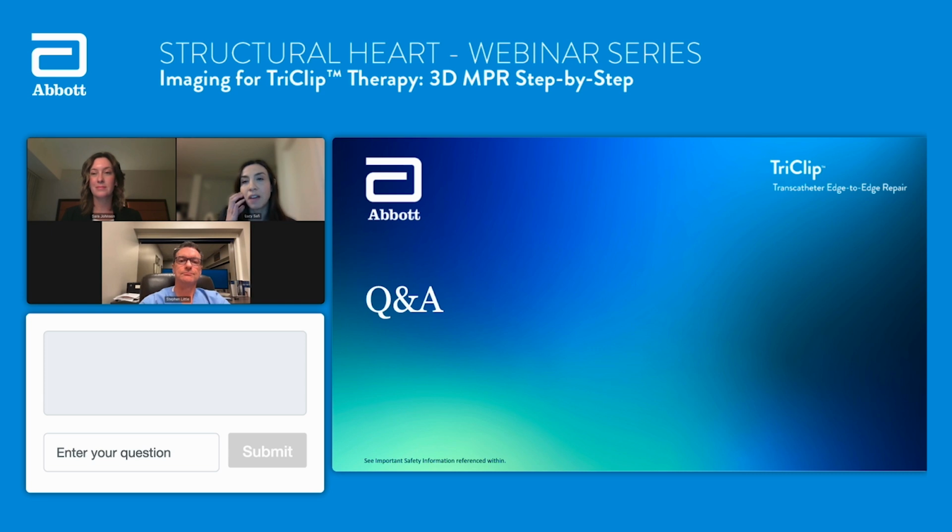I think the fact that with the MPR, you're able to see those 4 views simultaneously really does help the proceduralist. He or she can see in one image whether the clip slightly rotated, or is my trajectory on axis? And it really does minimize the trauma to the patient's esophagus. But to be honest, you can't get it in every patient. And if you have great 2D pictures with biplane, sometimes that's all you really need.